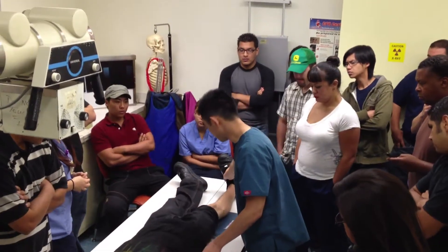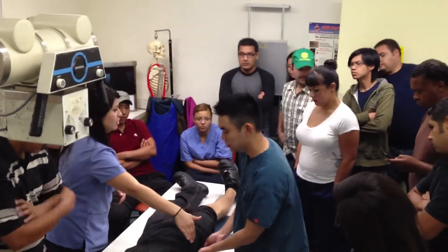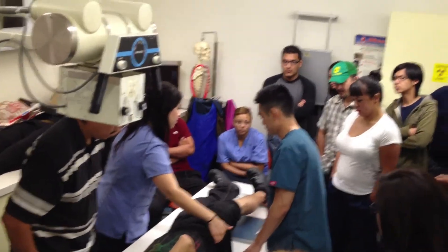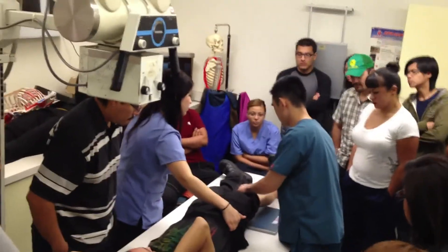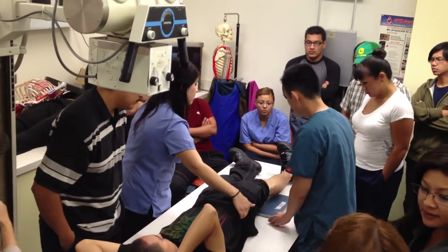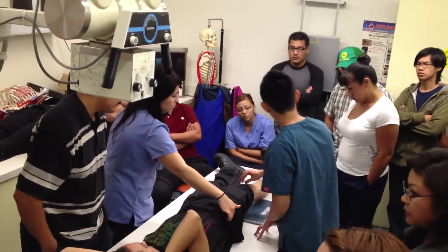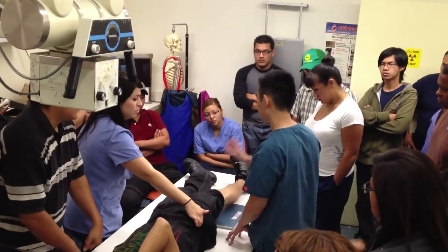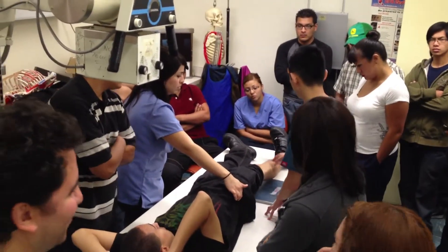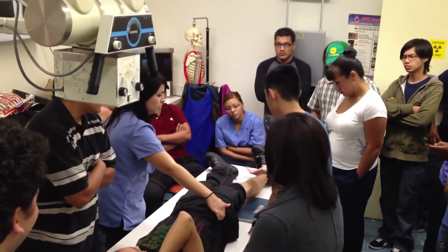I'm going to have you rotate it a little bit more and actually have the patient lift their hip up just slightly. You try to visualize the patella like halfway over — there's a tongue on the cassette. You set the same centering.